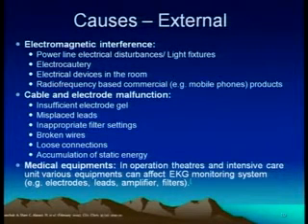Insufficient electrode gel is very important. Sometimes too excessive or too little will of course give an erroneous reading. Misplaced leads, as I already mentioned, inappropriate filter settings, broken wires, half-broken wires, loose connections, and of course accumulation of static energy. This will produce this.